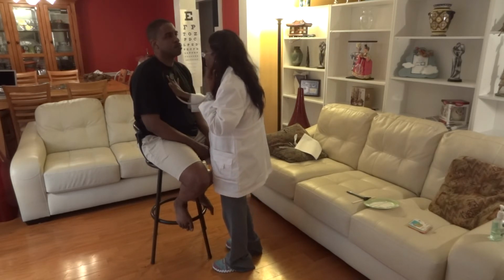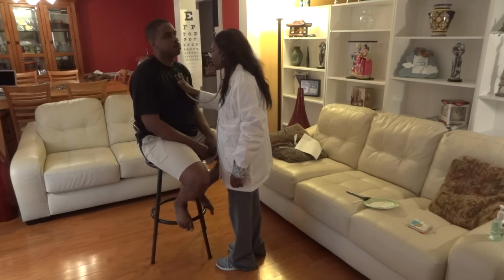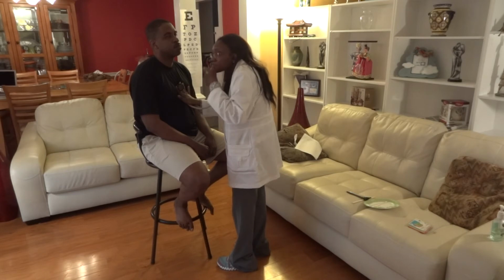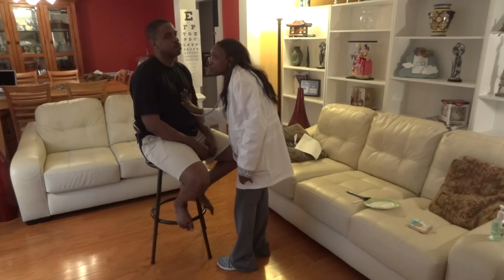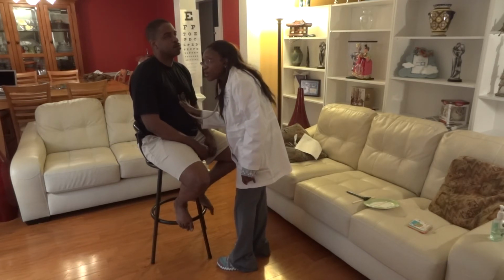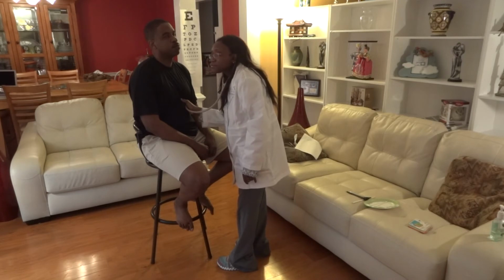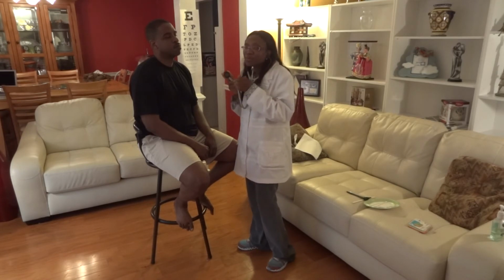And now we'll auscultate the heart for any extra heart sounds. Moving along the left sternal border, the 2nd to the 5th intercostal space, just like I did with the diaphragm of my stethoscope, and also the apex. Okay, no extra heart sounds were heard with the bell of my stethoscope.